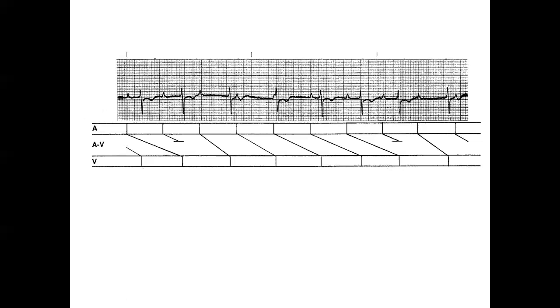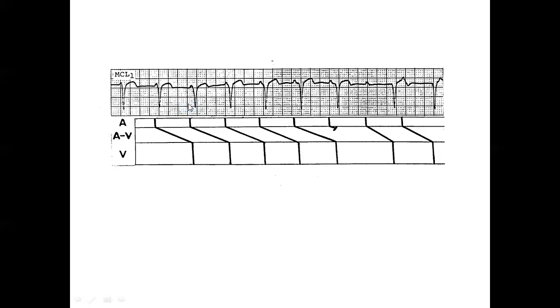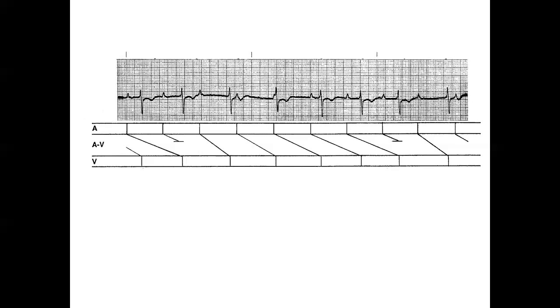Okay. The way to visualize this is, it is not complete AV block. First of all, P's are occurring regularly, and there's a group beating. So you have to make, oh, I'm dealing with the Wenckebach phenomenon. In Wenckebach phenomenon, which is the first beat of the cycle? After the longest pause. So this is the first beat of a cycle. Then, okay, this is the first beat. What is the P? You look for P in front of it, it's there. So it's this P conducting to that one.